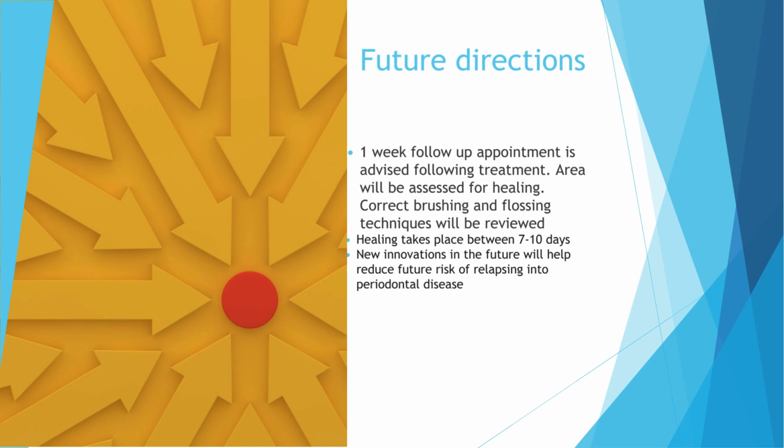Future directions. One week following your appointment, a follow-up appointment is advised. The area will be assessed for healing, and correct brushing and flossing techniques will be reviewed. Healing usually takes place between 7 to 10 days. New innovations of the laser periodontal treatment include reducing future risk of relapsing back into periodontal disease.